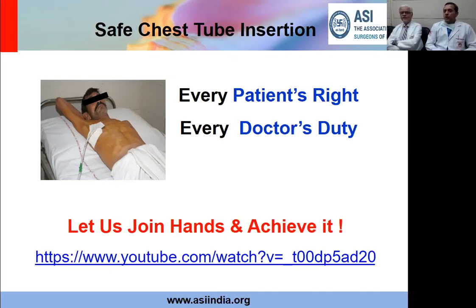Yeah, so the advice would be, suppose the patient is being shifted somewhere and somehow the tube gets inadvertently pulled out, the resident or the nurse, whoever is there, their first response, the reflex, should be to take a sterile gauze piece of cotton and just block that hole and put an occlusive dressing. That's number one. If the patient is having an air leak, then it's an emergency that you put the tube in as quickly as possible. But if the patient was not having an air leak, then you could take time. At the most, fluid will collect.